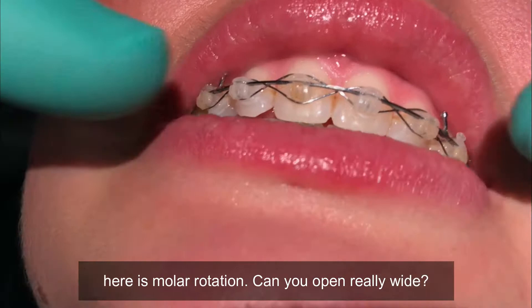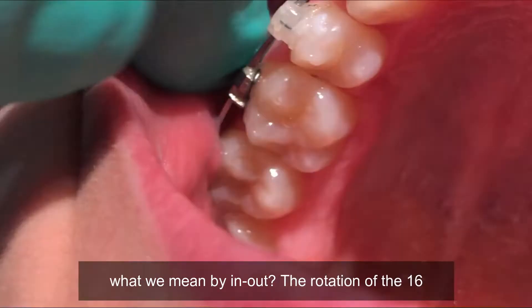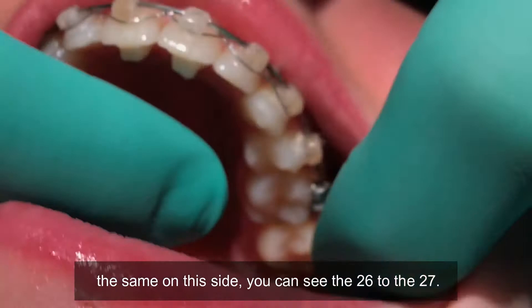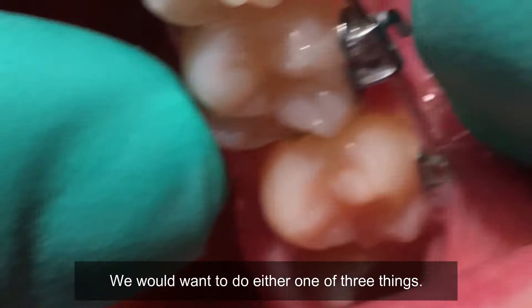The main thing I want to talk about here is molar rotation. Can you open really wide? If you look at the 16 to the 17, can you see what we mean by in-out? The rotation of the 6 to the 7 could be caused by the molar tube being too mesial or too distal, or could be caused by excessive in-out in the molar tubes. And if you see the same on this side, you can see the 26 to the 27.